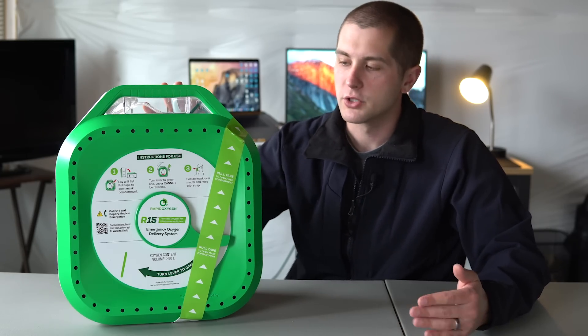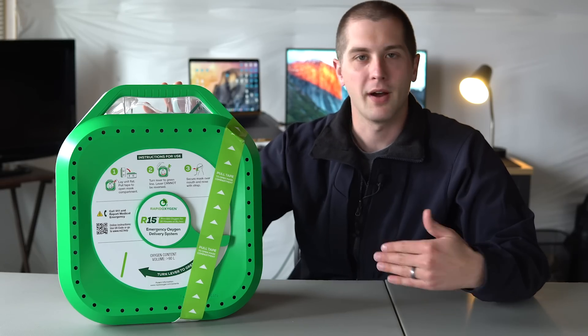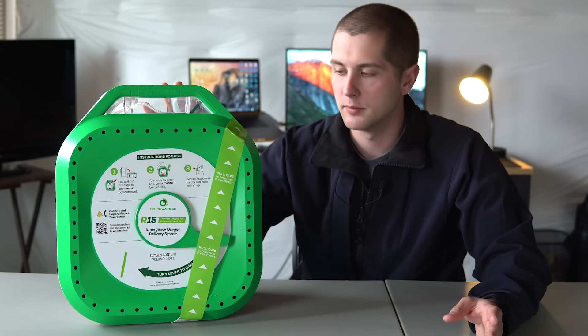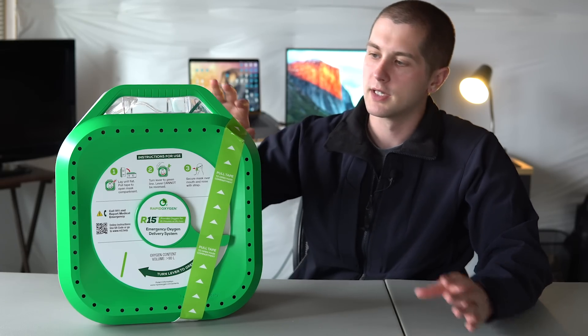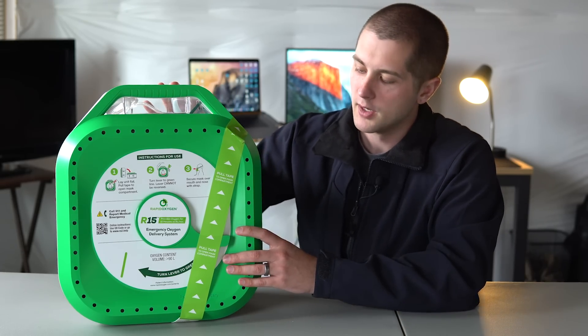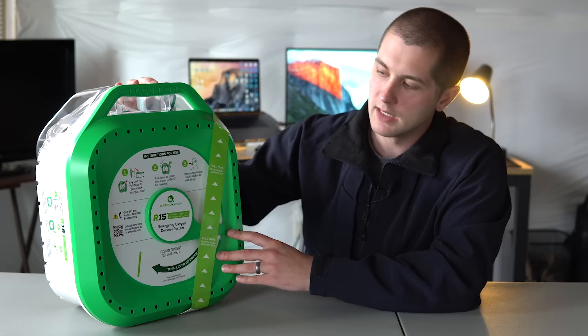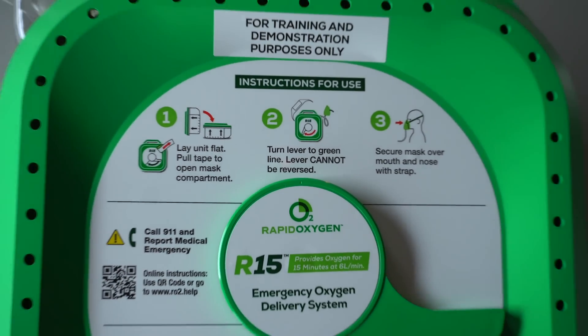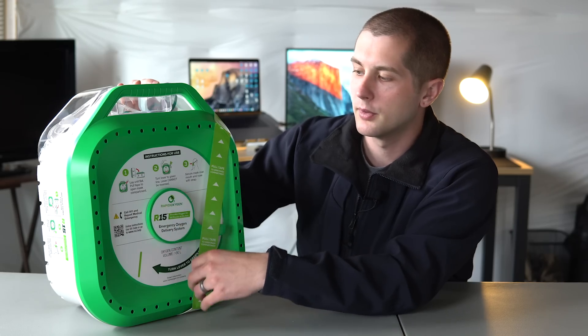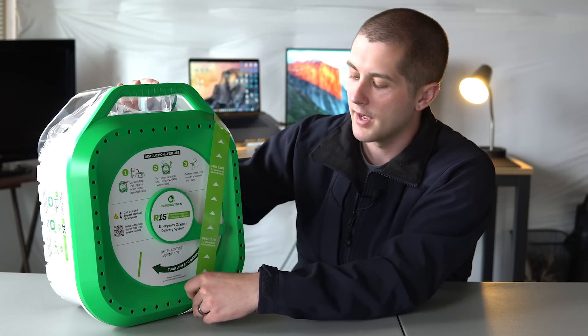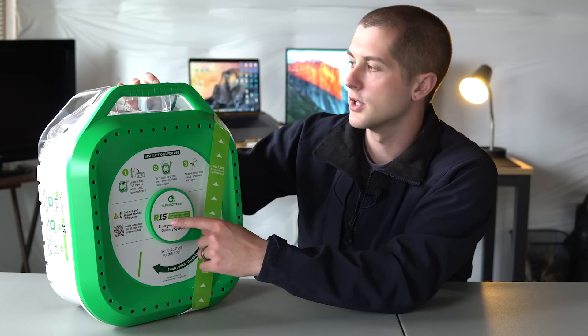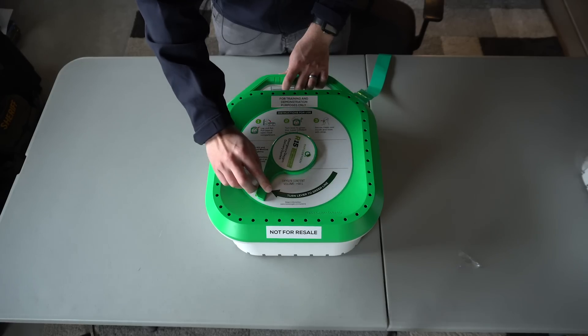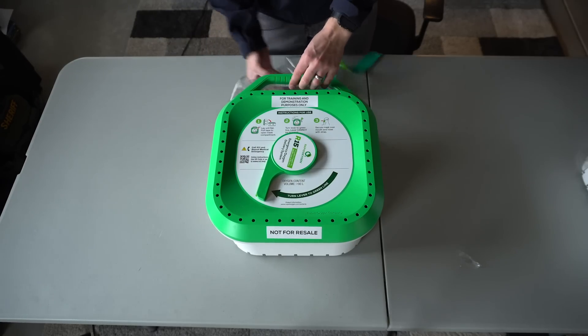So now I want to show you guys a quick demonstration on how this works and kind of how simple it is and intuitive. It doesn't really require any training, like I said before, but it is good to kind of have a familiarity with it. So very similar to an AED on the front here, you have instructions one, two, and three. So you have to take this unit, you have to lay it flat and you're going to pull the tape to open the mask compartment. And this tape is going to free up this lever as well as open up the plastic compartment at the top.